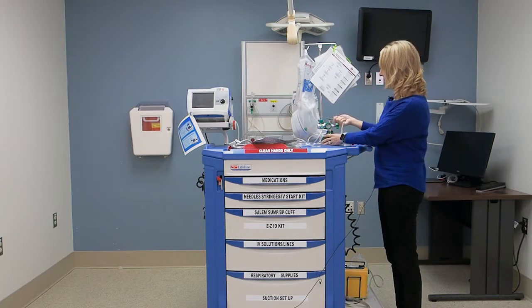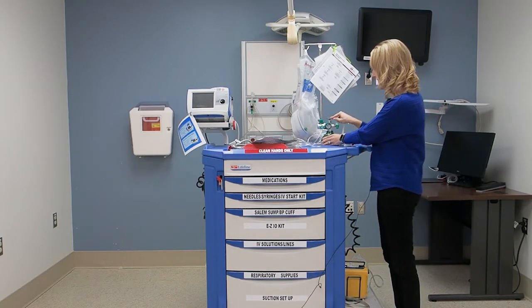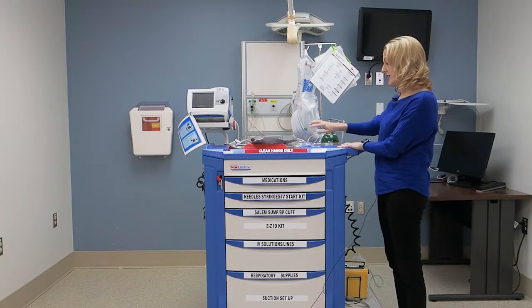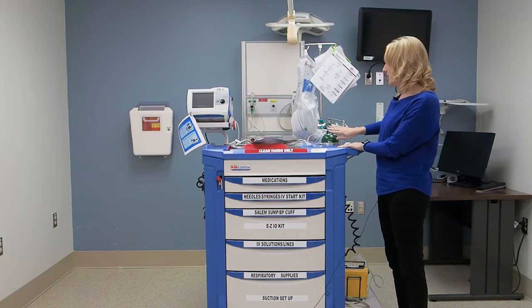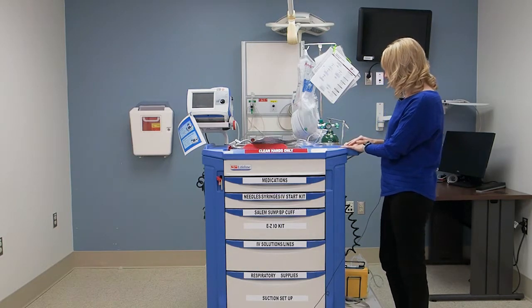And then, if you want to do a double check, make sure that the valve to the tank is off, and it is. And again, you will see that the arrow is in the red, and that's how you correctly check the oxygen tank, and how full it is.